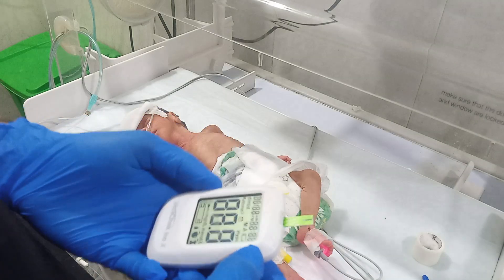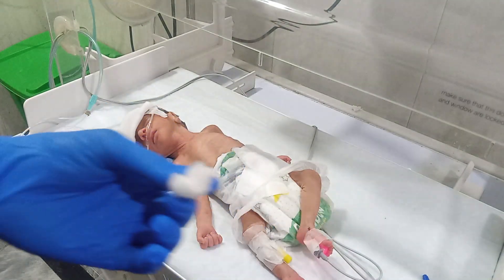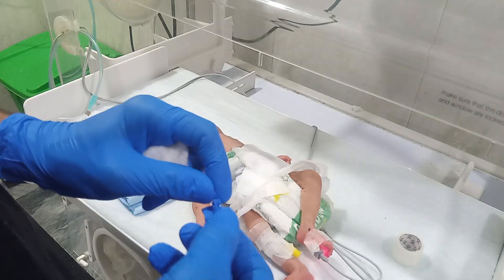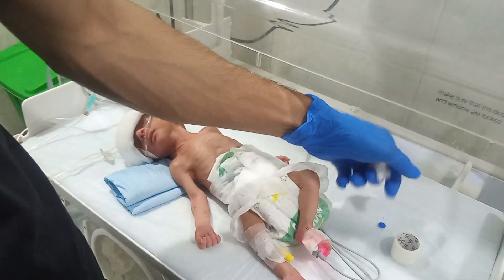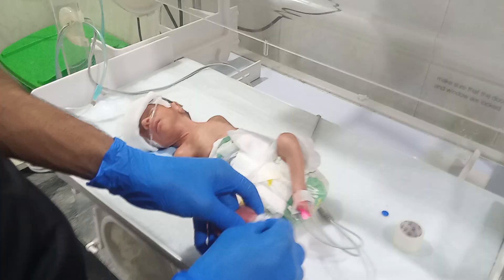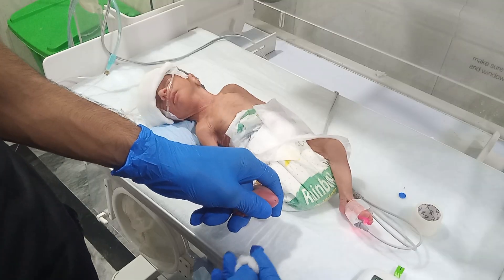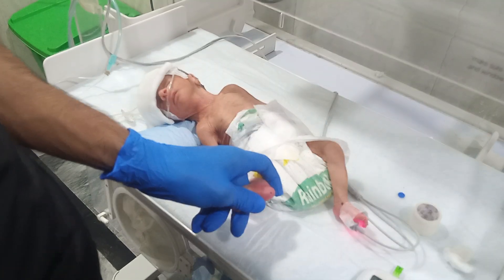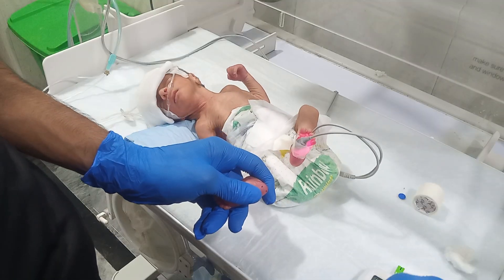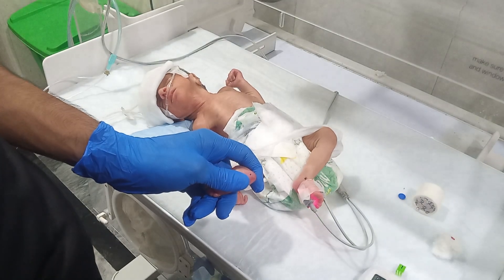This is the meter — this is the equipment. We are going to prick the heel of the baby. You should clear the first blood because the first blood doesn't give a perfect reading.